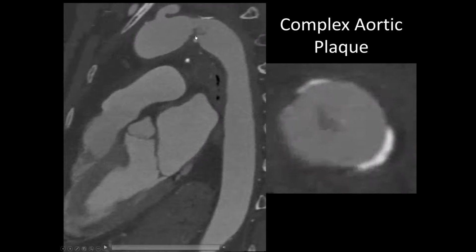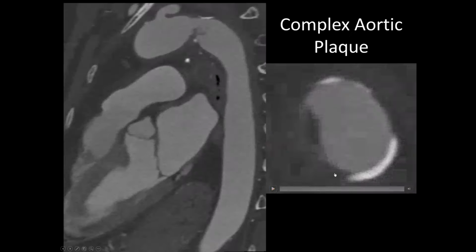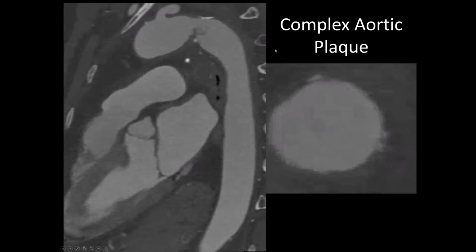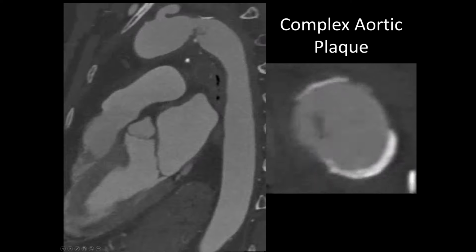So this actually, even the one before, this was moving all over in there. You can see it flapping all over in the lumen. And in this image also, you see it moving all over in the lumen. And the same thing was happening here. So basically, we were able to get video which showed us that you have this plaque which is moving now. So again, it confirms that there is a big thrombus there. I think it was measured out that the whole lesion is like 9 millimeters. You have this big thrombus here which is still moving in there. And so this was really concerning.